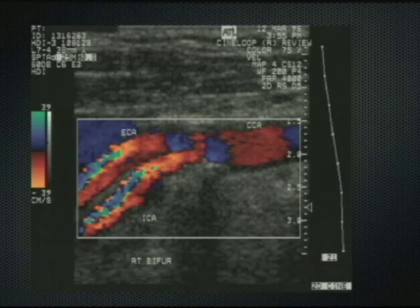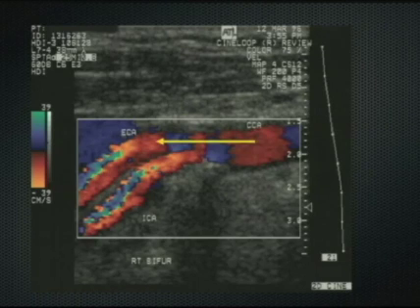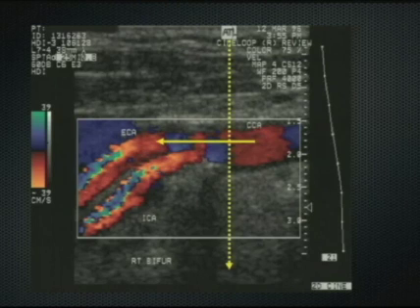And here we can see a broad range of colors reflected at different sites within these vessels. At the bifurcation and in the distal common carotid artery, we can see red, blue, red, blue. And the problem here is that the Doppler angle is almost 90 degrees. In addition, because the Doppler angle is very large, there's ambiguity in terms of the relative direction of these small Doppler frequency shifts, and therefore the colors shift from red to blue.